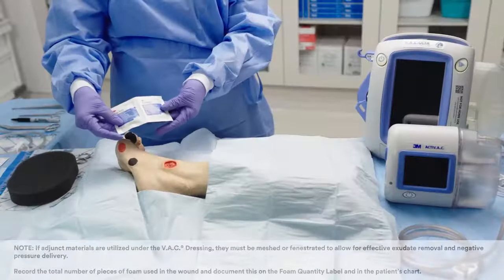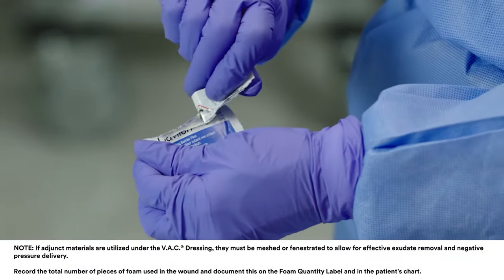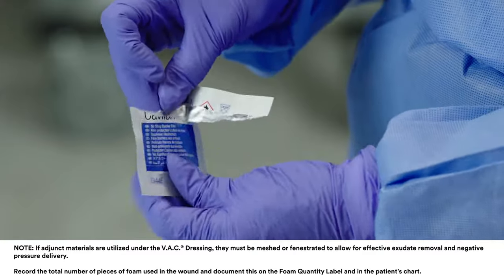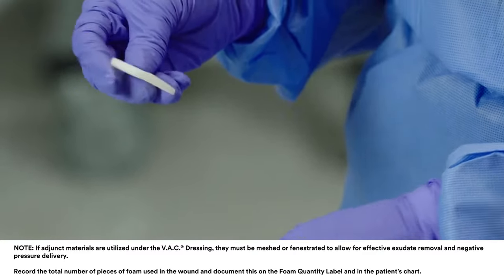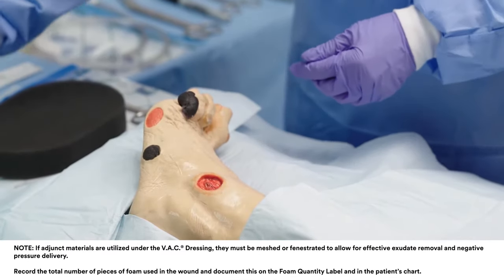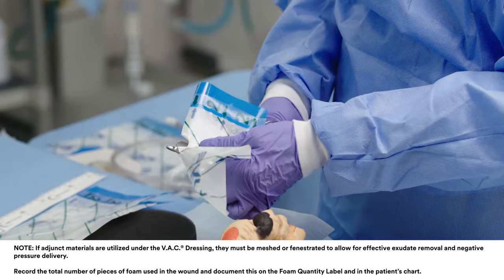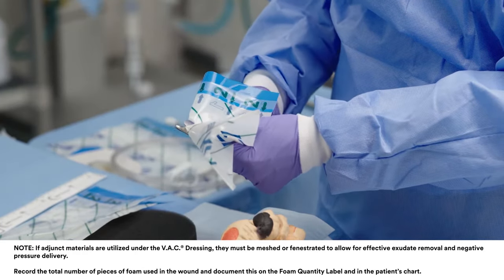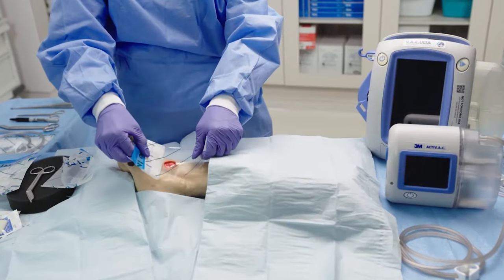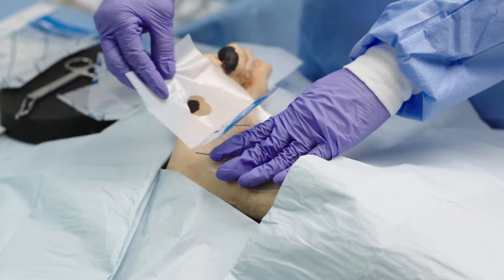Ensure adequate hemostasis has been achieved. Shown here is a small wound requiring a standard VAC dressing. Prepare the peri-wound area by applying a protective skin barrier preparation, such as 3M Cavilon no-sting barrier film. Picture frame or windowpane the wound with a hydrocolloid dressing or another vapor-permeable adhesive film dressing, such as VAC drape or 3M Tegaderm transparent film dressing.